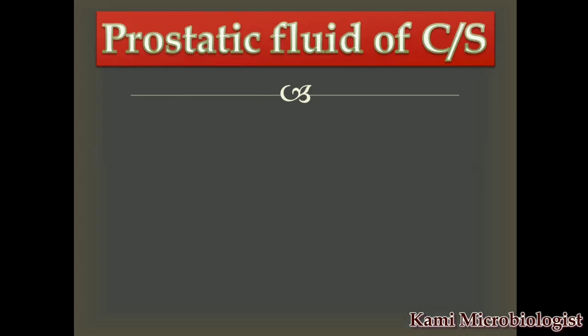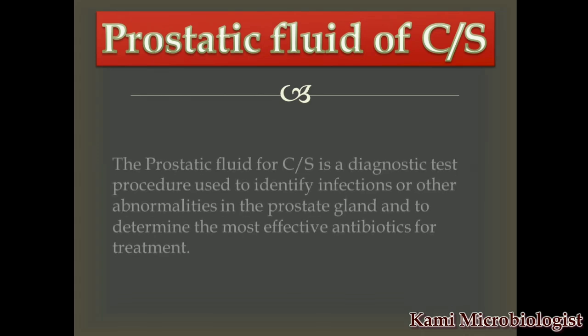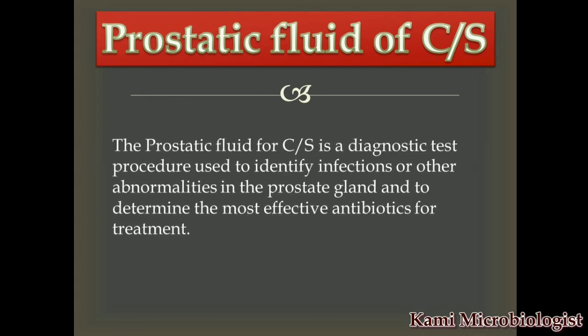Now let's see the prostatic fluid for CS. Dear viewers, it is actually a microbiology test, or we can say a culture test, in which we can identify the specific type of bacterial or fungal infection, mostly bacterial infection, that can cause abnormality in the prostate gland. After that we determine the most effective antibiotic that can be used for treatment. So this is the prostatic fluid for CS.